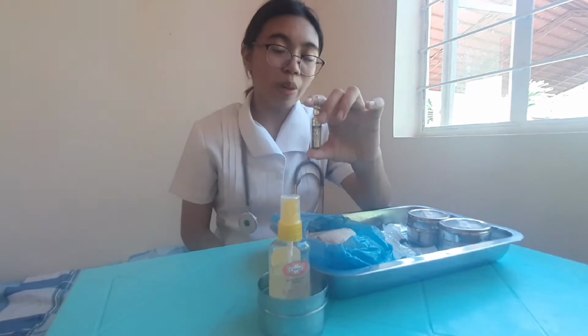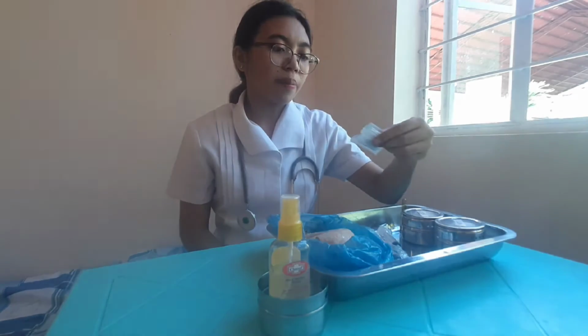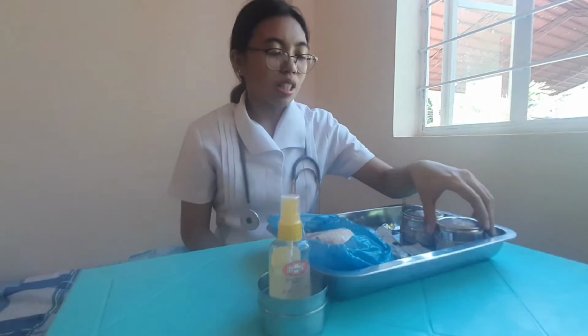Specifically on the equipment, the very important thing is the ampule. This is a paracetamol ampule. The expiration date on this is August 2023. We have here the syringe, the disposable syringe, another syringe, and a precision needle syringe.